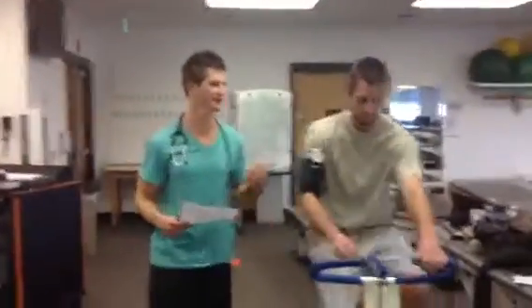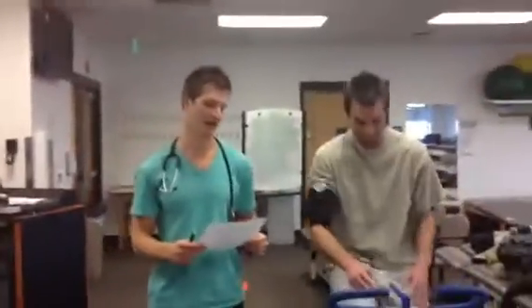My name's Tim Richardt. This is my subject, Denny Bartha. We're going to be conducting an Astrand cycle test. It's a submax exercise test. Going to get his approximate VO2 max from that.